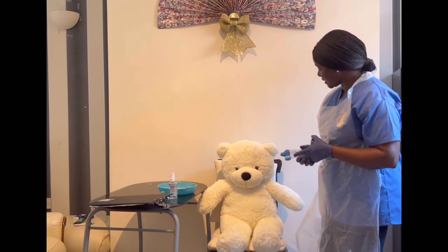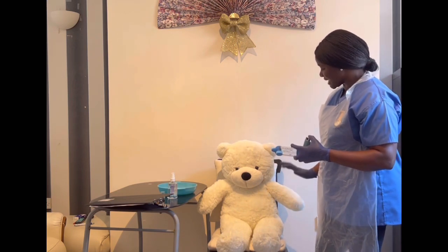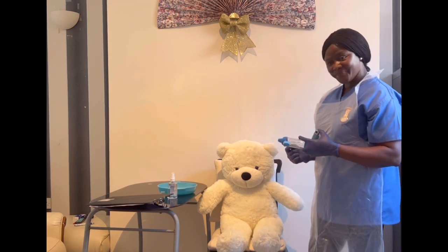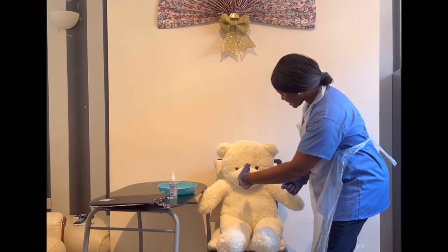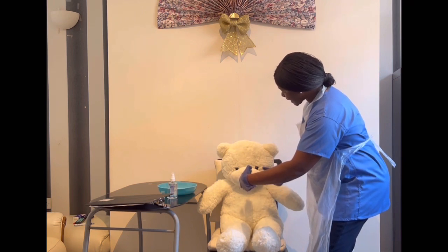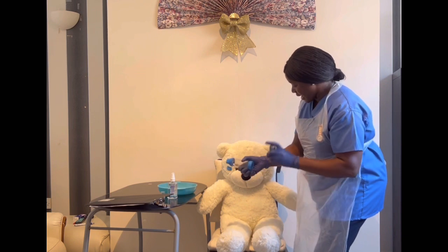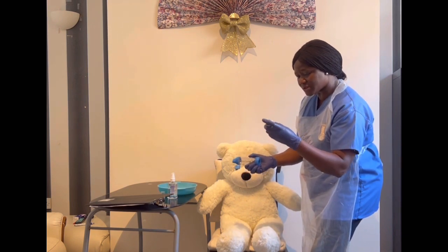Is that okay, Harry? Yes, nurse. Are you ready? Yes, nurse. Okay, you're sitting upright already. That's fantastic. Can you tilt your chin a bit for me, Harry? That's wonderful. Can you form a tight seal with your lips? Okay, without biting it. That's wonderful. Can you begin to breathe in slowly for me, Harry? I'm going to shake your inhaler for 3 to 5 seconds.